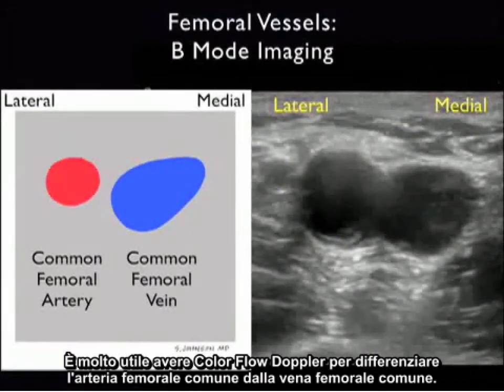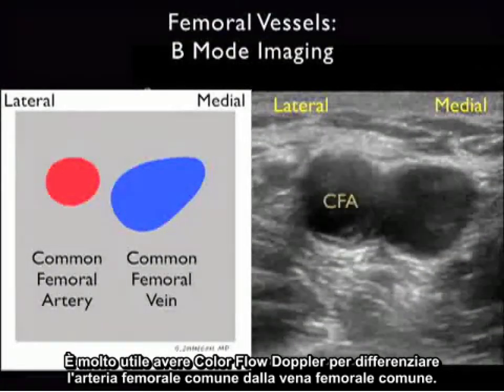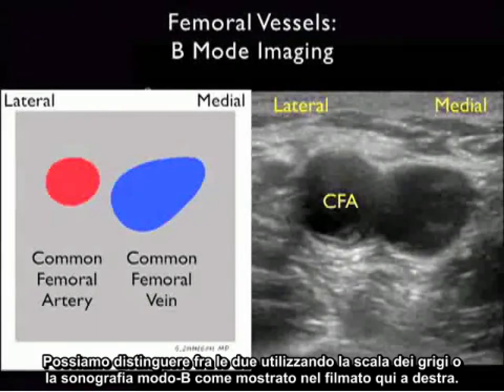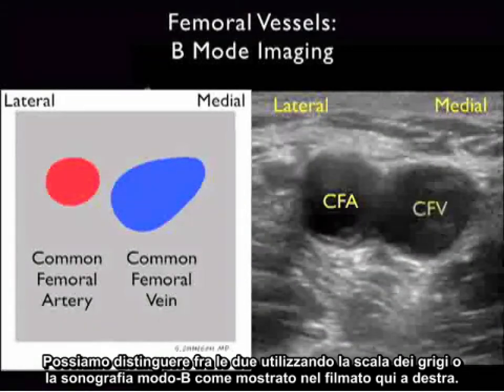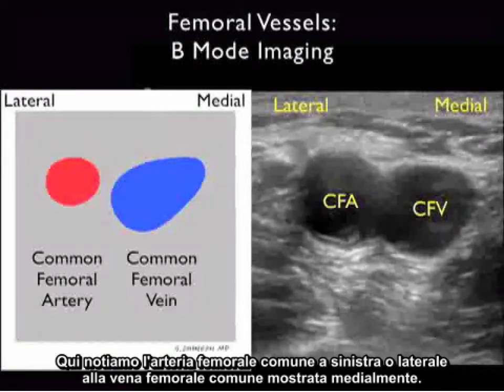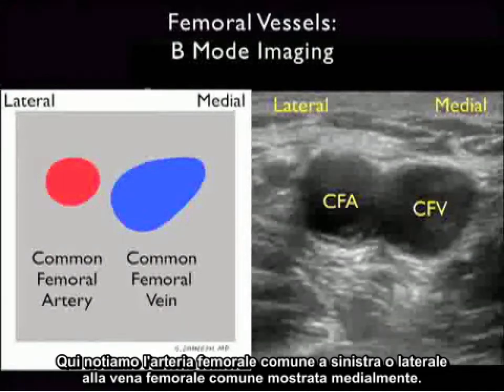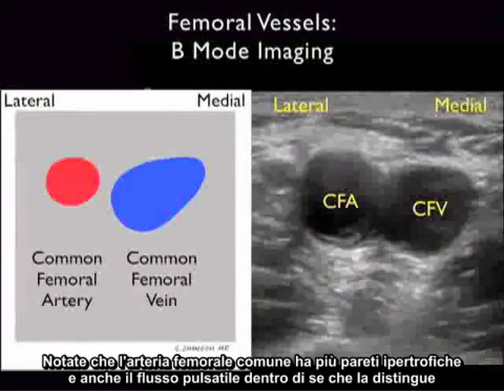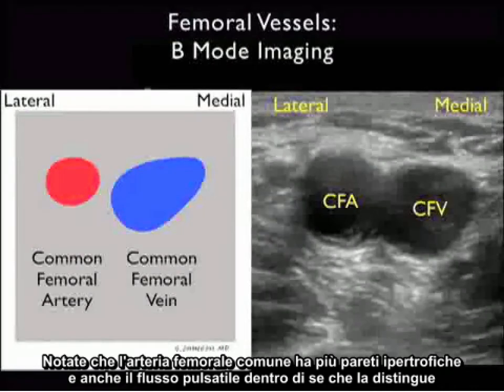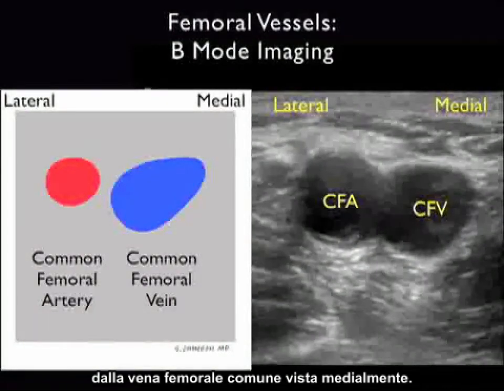While it's very nice to have color flow Doppler to differentiate the common femoral artery from the common femoral vein, we can also discern the two using grayscale or B-mode sonography. We note the common femoral artery to the left or lateral to the common femoral vein. Notice that the common femoral artery has more hypertrophic walls and pulsatile flow within it, differentiating it from the common femoral vein seen medially.